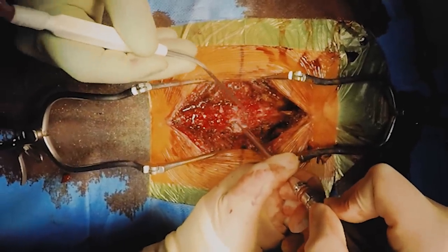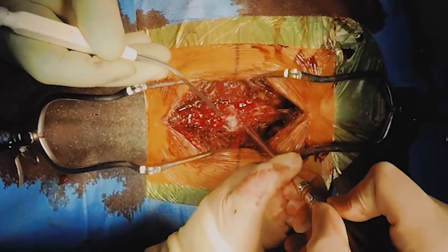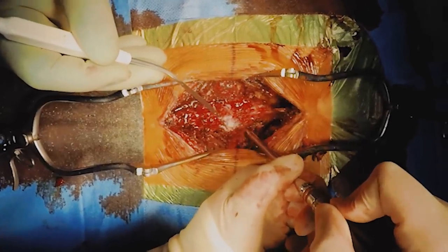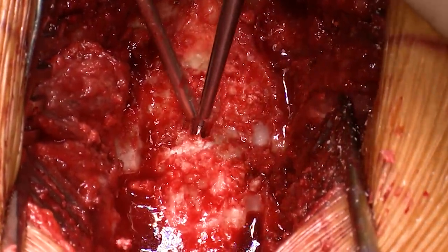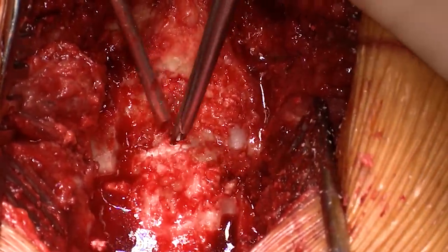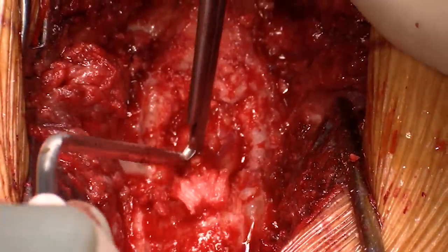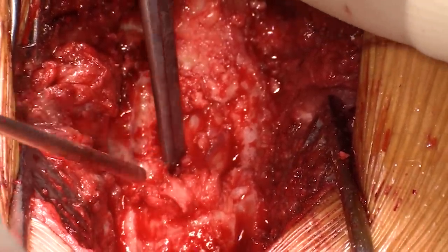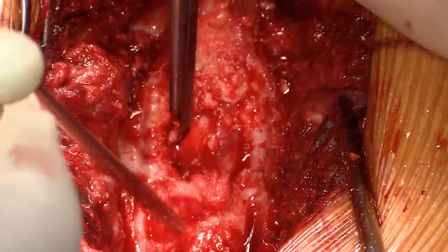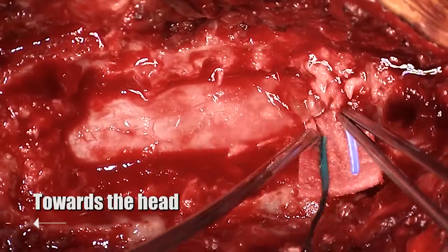Now you can see the drill being used and this is making a gutter on either side of the spinal canal and we're going to use that as a way to get into the spinal canal. Lots of drilling needs to be done at this point but once we've made a tiny entry point we can use these Kerrison rongeurs to just start chewing away safely at the bone and give us some access to the dura and the spinal cord underneath. Remember the dura is the leathery outer covering of the spinal cord that you can see right here.